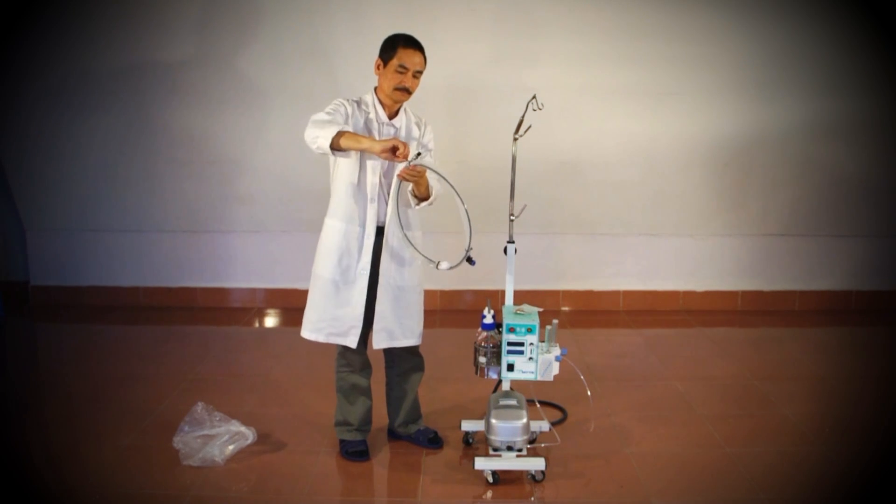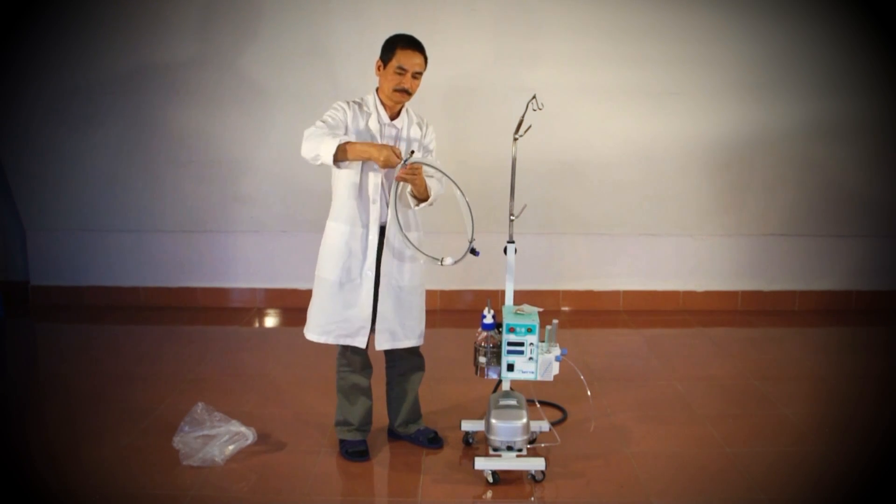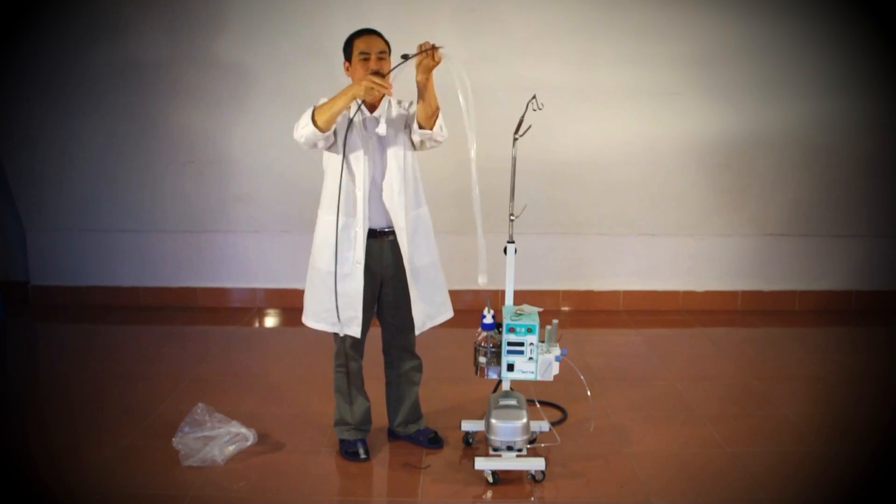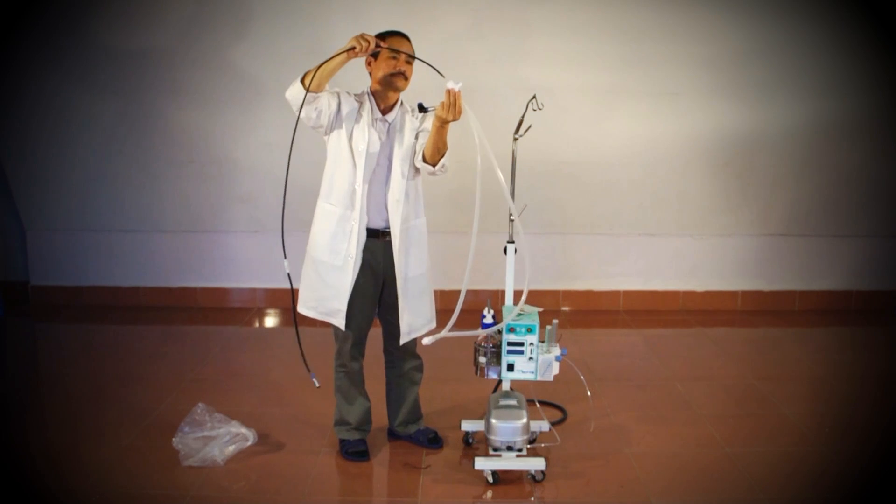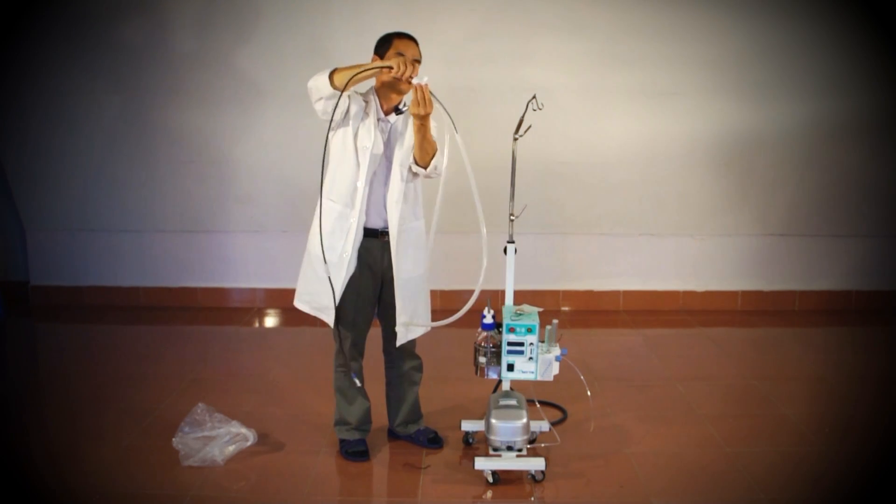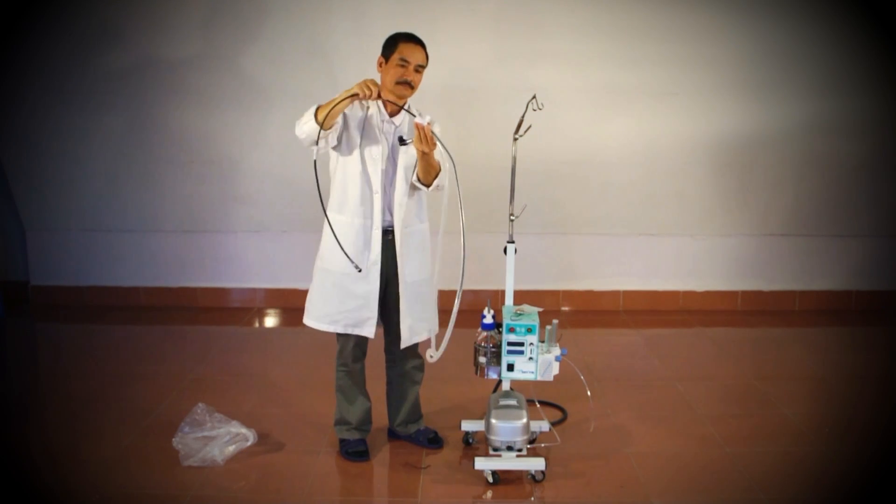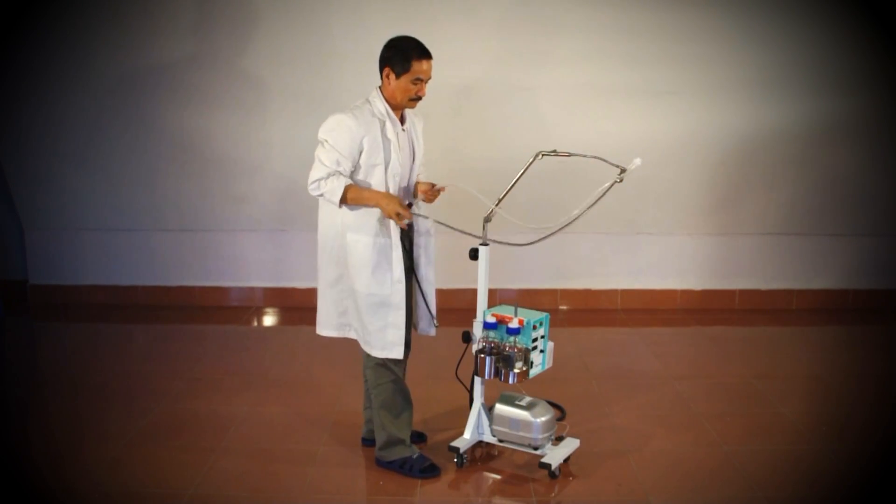Once the bottles are in place, we can connect the patient circuit or tube set. We start by inserting the heater wire into one side of the silicon tubes. Like this. Once inserted, attach the patient end of the patient circuit to the CPAP arm.